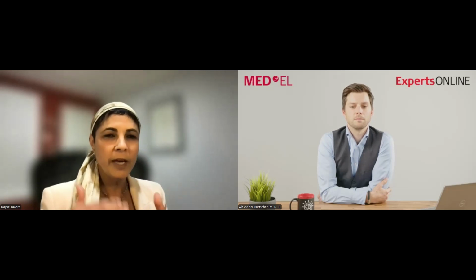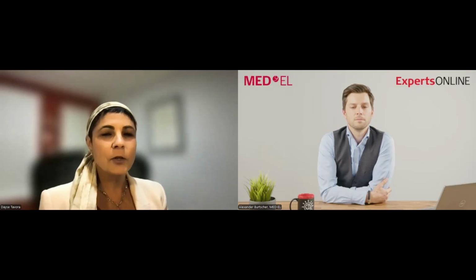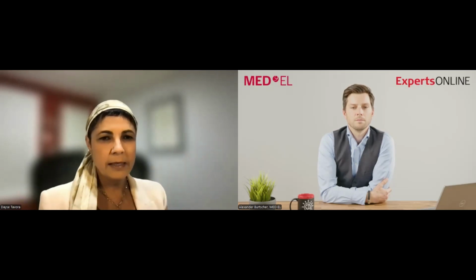Well, for this type of measurement, it needs to be really live. So that's what we do with our traditional remote, where we send equipment, and then we do all the measurements, whether it is too loud or too soft. With this system, it is still not really live. It is based on what the patient tells me, for example if the sound has changed significantly in the last 3 months.